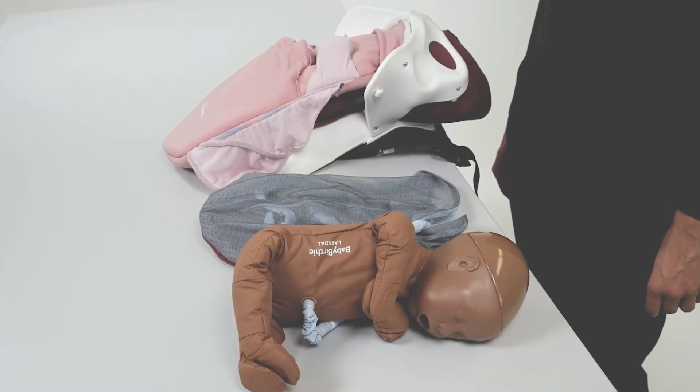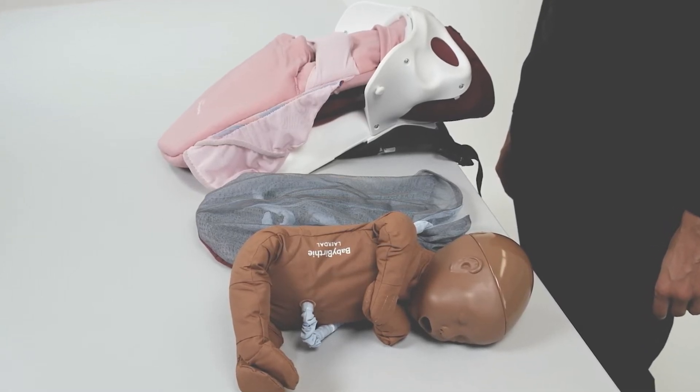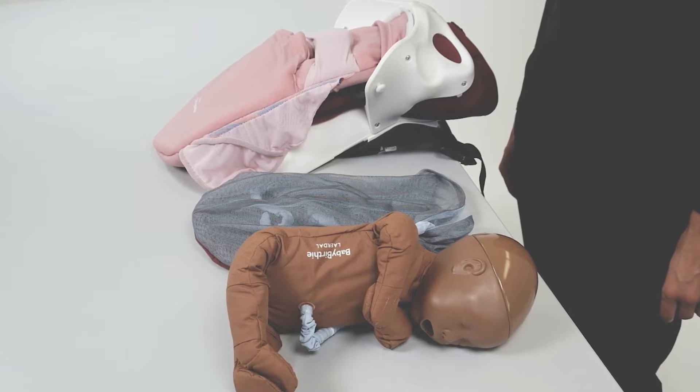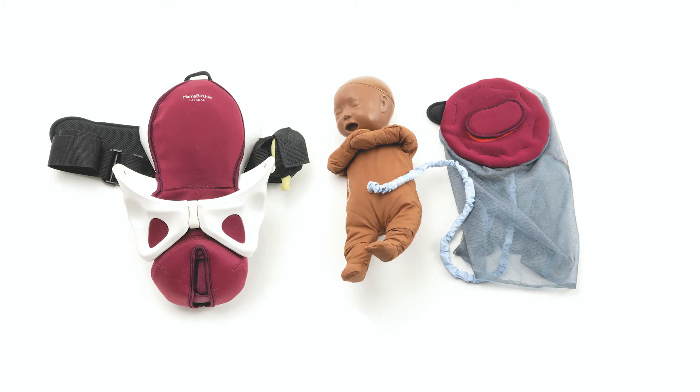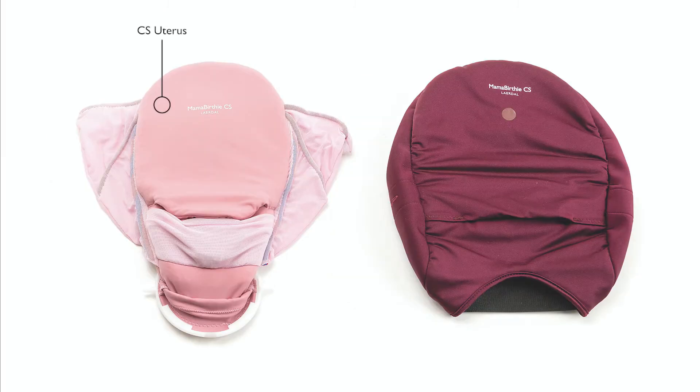This is an instructional video showing how to set up Mama Berthy CS. To get started, you'll need Mama Berthy, Baby Berthy with Placenta, and the CS module, including the uterus and abdomen skin.